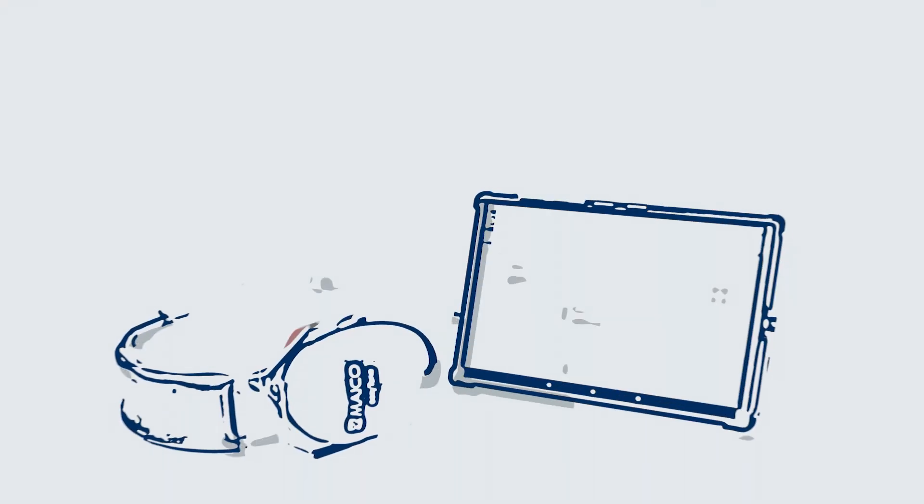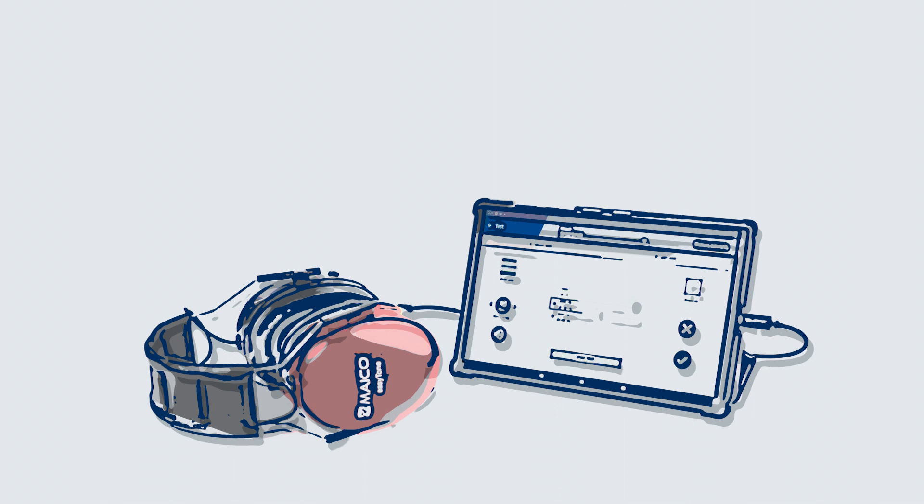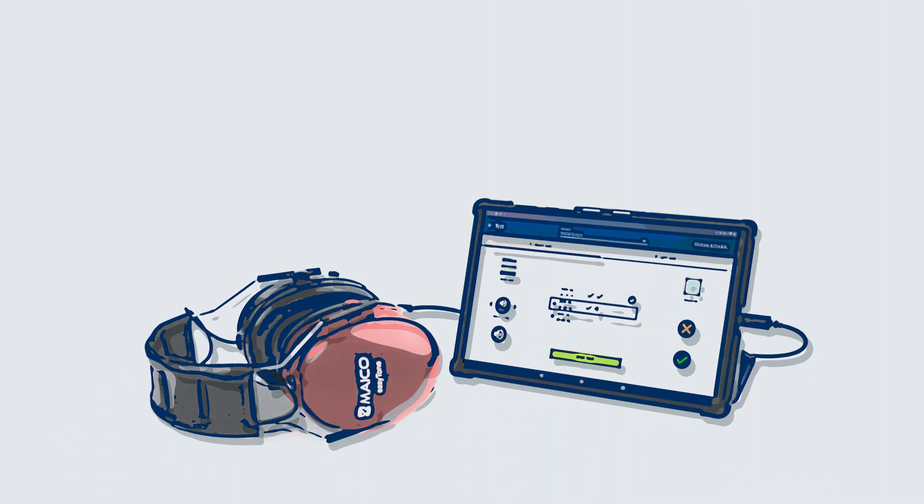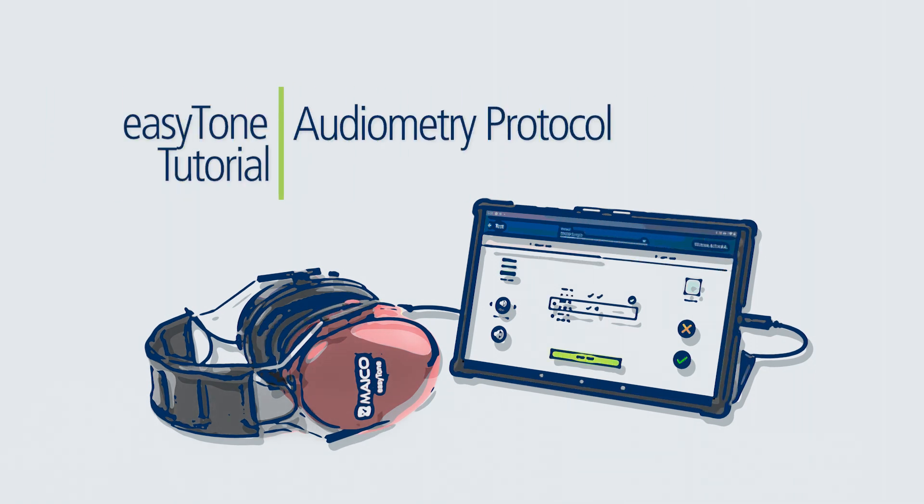This completes this tutorial on creating a pure tone audiometry protocol. Please continue through the tutorial series for additional EasyTone instruction.